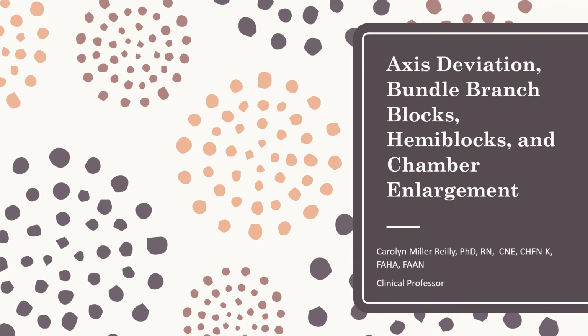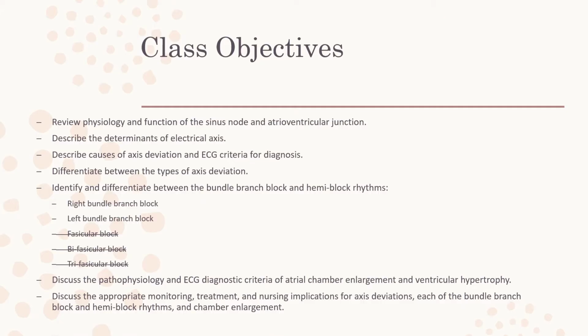Good morning. Okay, today we're going to cover axis deviation, bundle branch blocks, hemiblocks, and chamber enlargement. We've got a lot to cover. This is a fairly complex topic. It's a little bit more involved than what we've had in the past with just identifying rhythms. These are some hard concepts.